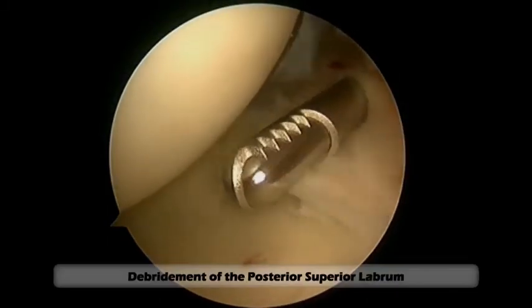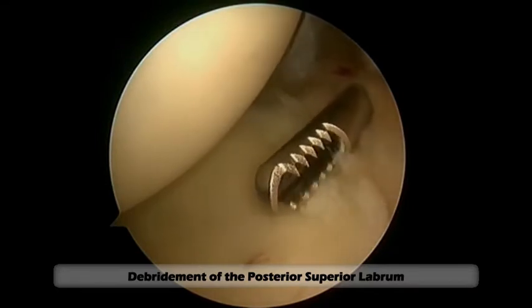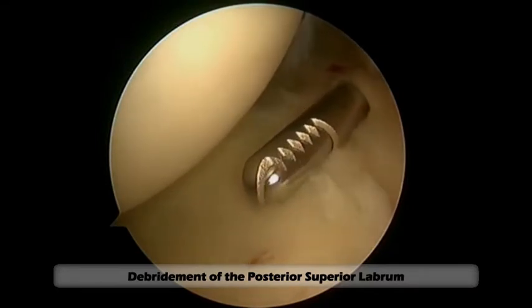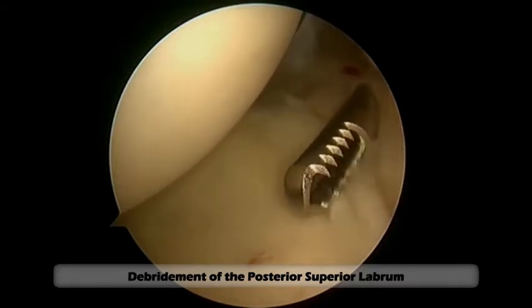A shaver is then introduced through the posterior portal and a debridement of the labrum and rotator cuff is undertaken.